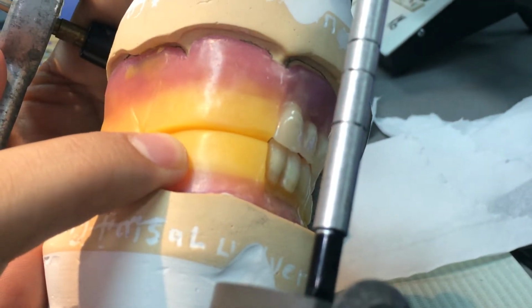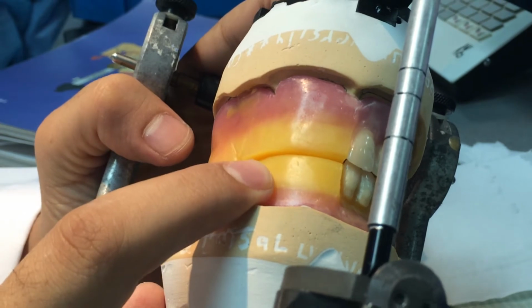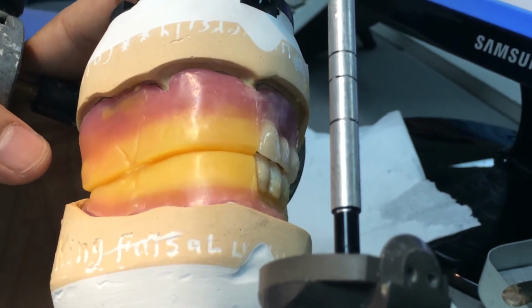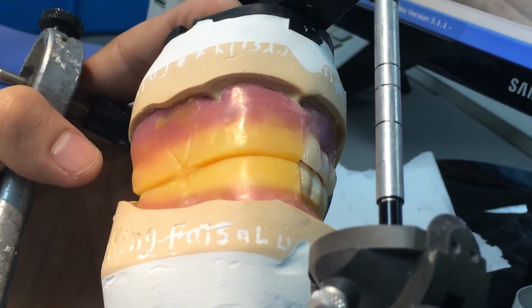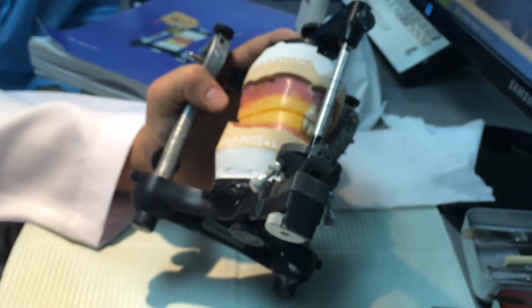The doctor said, in the stage when we started working on the wax rim, we always made sure, we say it has to be straight, a flat surface, right? And then it also has to be in occlusion and there is no space in between. Even if you make it flat, it's going to give you the same idea.